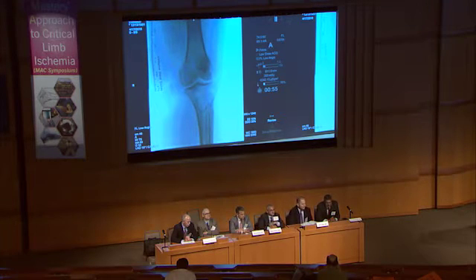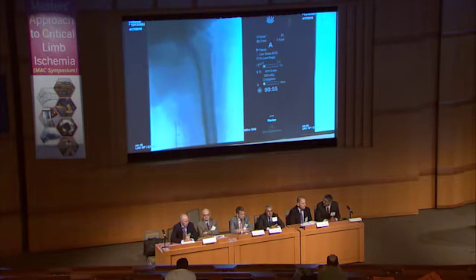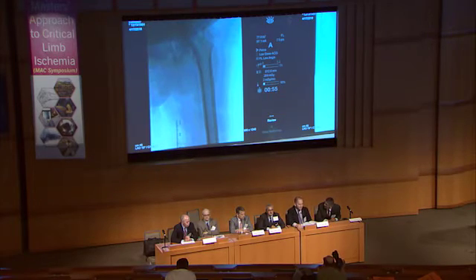Let me just wire this profunda for a second. So how many of you have actually seen this before? To be honest, I've been doing this for a little while, and I have not seen spontaneous fistulas in the SFA before. Alec, have you? So I really think that we're dealing with an AVM here.